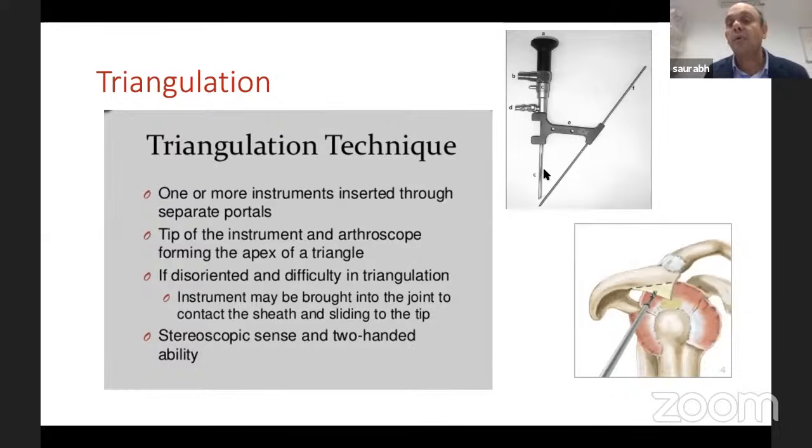So this is a very important tip. Touch your sheath and slide anterior, especially when you have just started to do shoulder scopes. So for example, here, that's the coracoid. So that is anterior. Your viewing portal is posterior. Arthroscopes come from behind. And as your shaver goes in, you can touch the arthroscope sheath, slide it just in the front, and you will start seeing your acromion. And then you can shave off the excess bit, which is what this slide says.